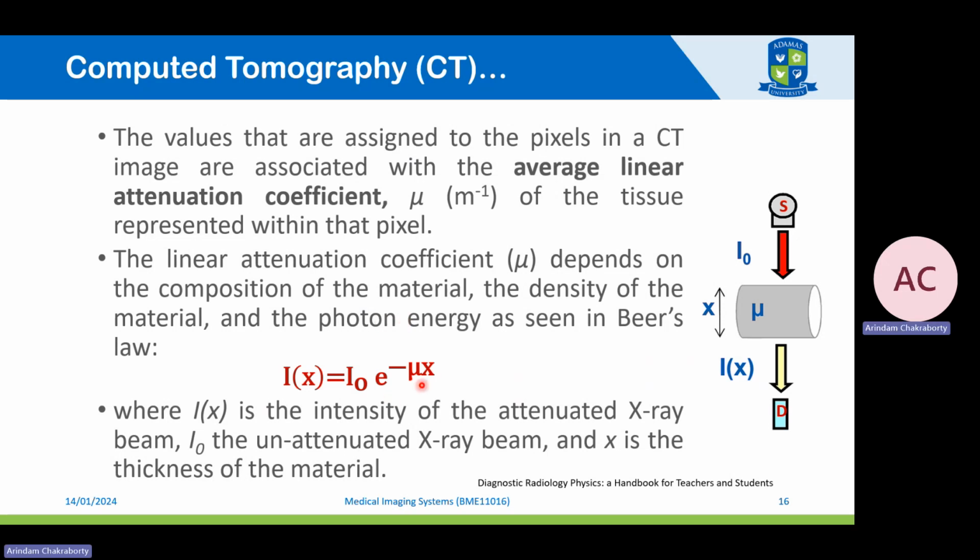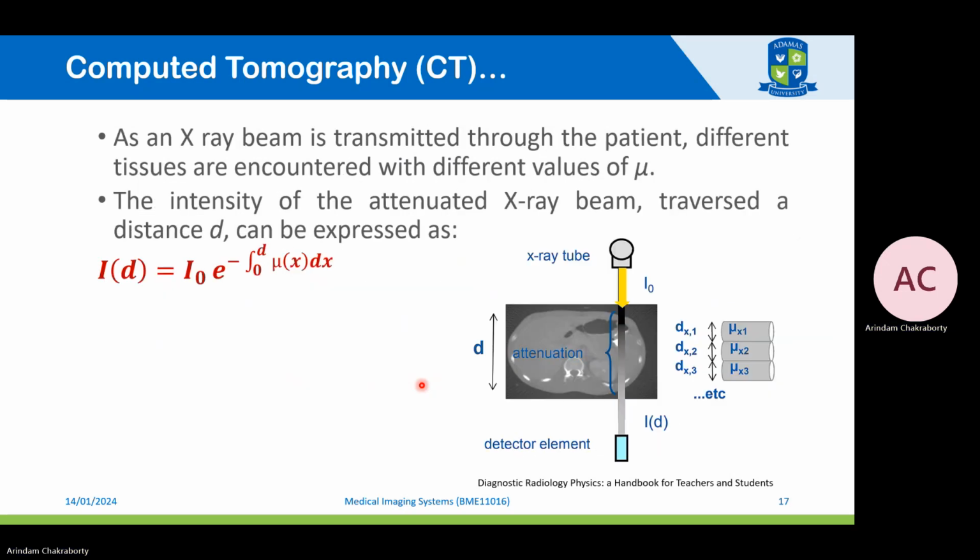So all this X-ray attenuation based data that is used to form the 3D structure or the 2D cross-sectional representation of the structure basically uses some algorithms to calculate the mu from all the data points of the projections. As I was saying earlier, this is how the X-ray attenuation, the linear attenuation coefficients, are used to calculate the computed tomography data.